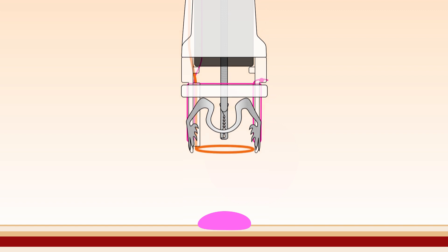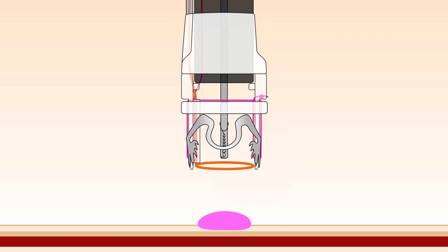The endoscope with the FTRD system is then approached towards the respective site. The affected tissue is grasped with a special grasping forceps which is inserted through the endoscope.